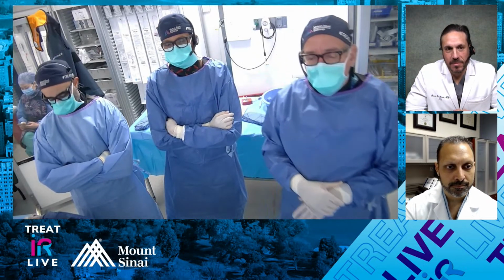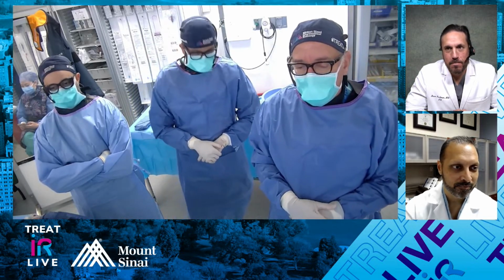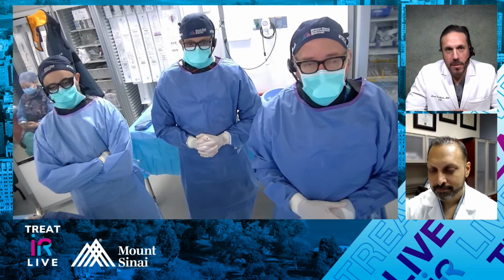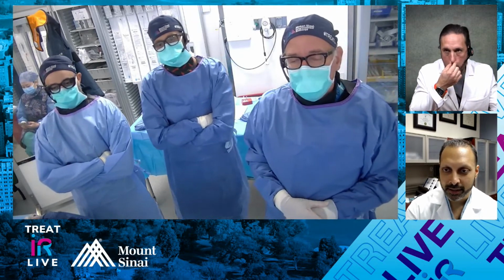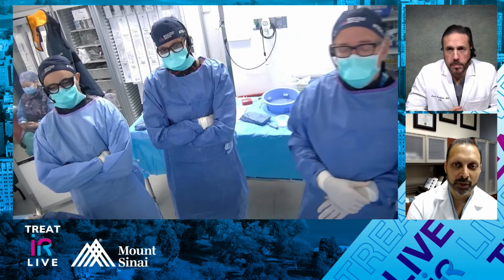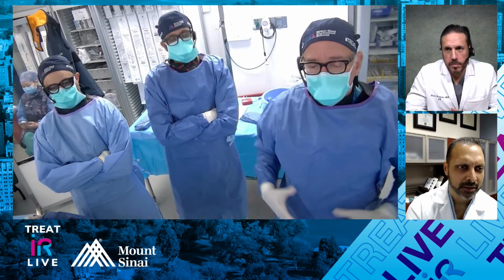So any closing thoughts? I think we're probably going to wrap this up. But just any last questions before we let you all go? I think that was a great case, Rob. I don't have any more questions per se. We talked about the post intervention med management, and maybe we could briefly mention when you're going to see the patient back in follow-up. Did you say the timeline typically?